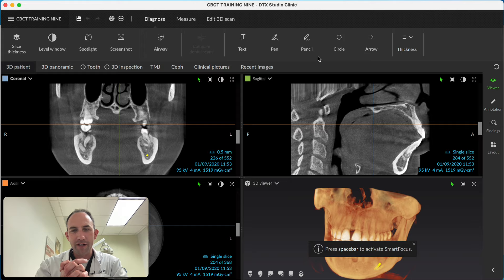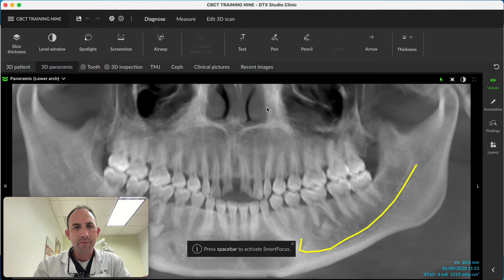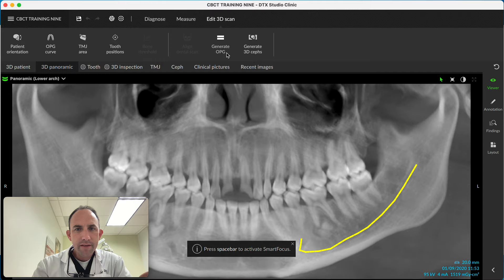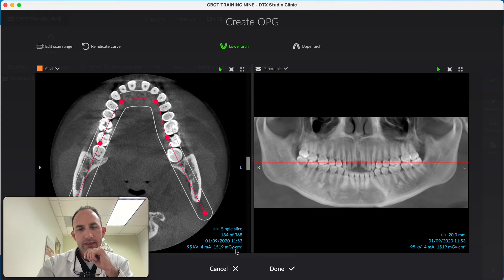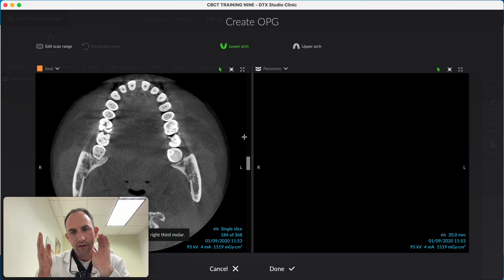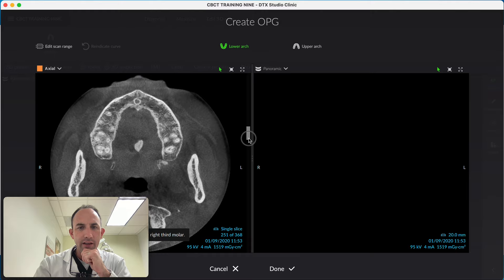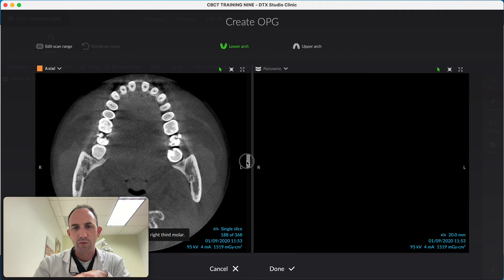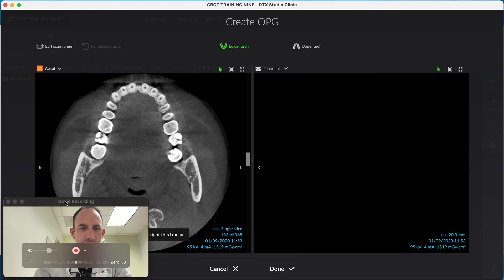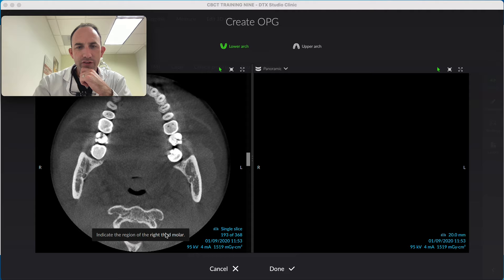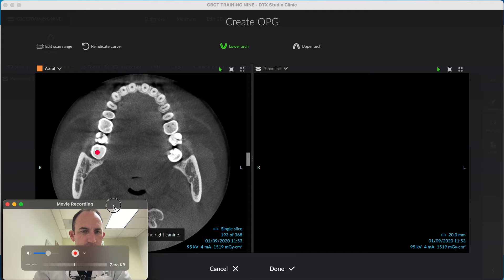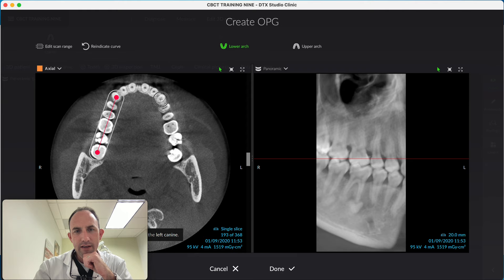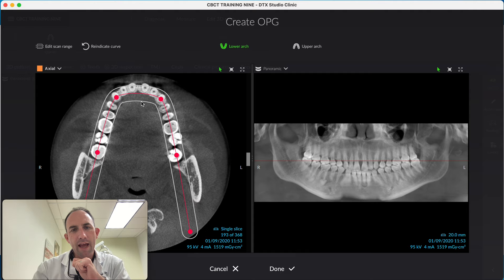Let's walk through creating a 3D panoramic. You can see the panoramic right here. When you get to 3D Pan, you click on it and see this screen. You can scroll up and down through the 3D pan and pick what works best for you. It's asking me to indicate the region of the right third molar — I'm going to click once on the right third molar. Now indicate the right canine, then the left canine, and then the third molar again.